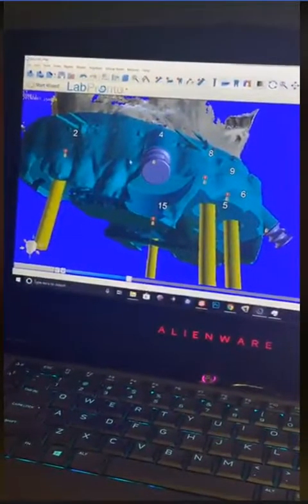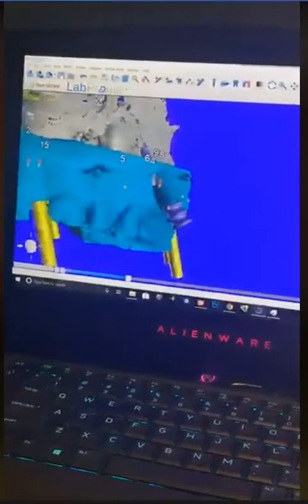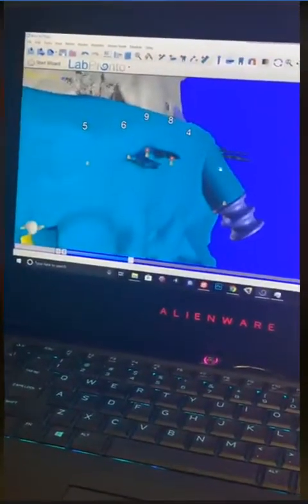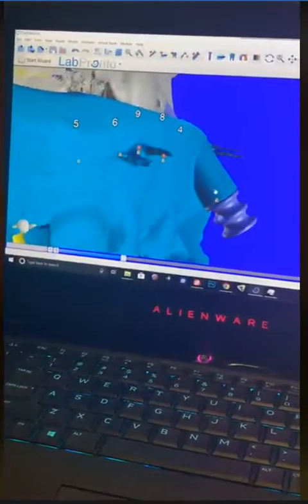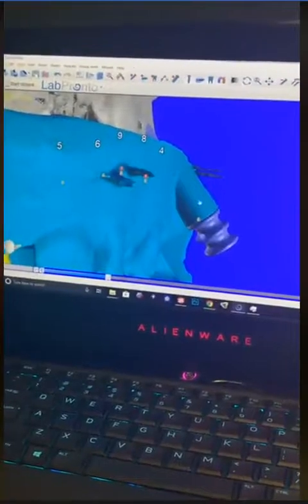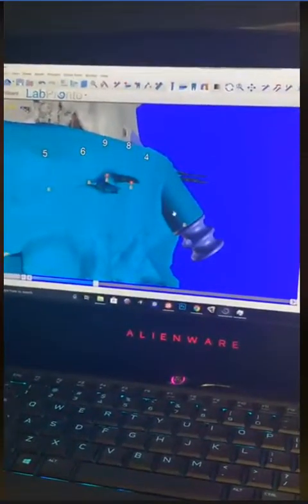And I put these guys in there. One of the things that I do that the program does not do, and I custom make them, are these supporting connections. The supporting connection that comes as a default is not this long, and it's not this small.